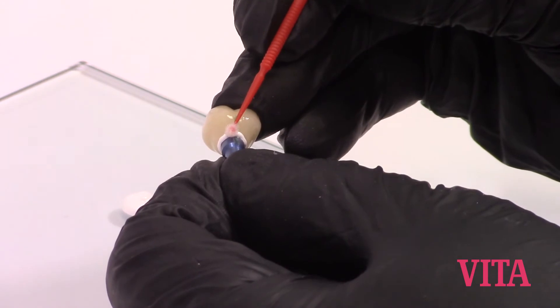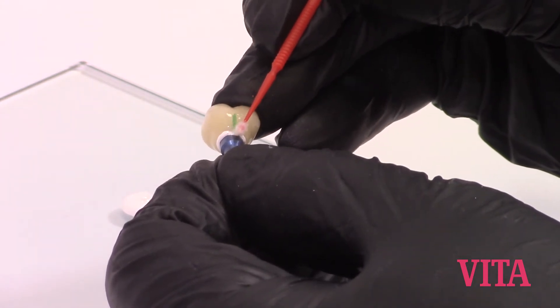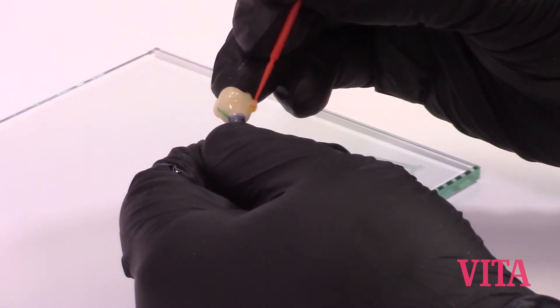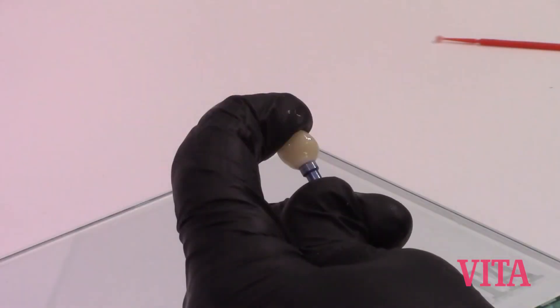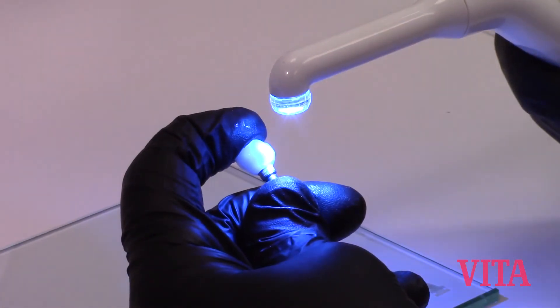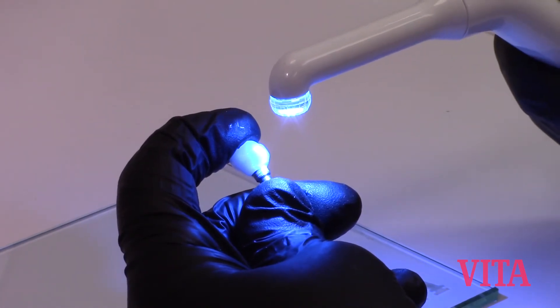Seal the margin and remove any excess. Apply a glycerin gel to the joint to prevent an oxygen-inhibited layer. Firmly hold the two components together, and using your operatory curing light, begin curing the adhesive just to tack it down.